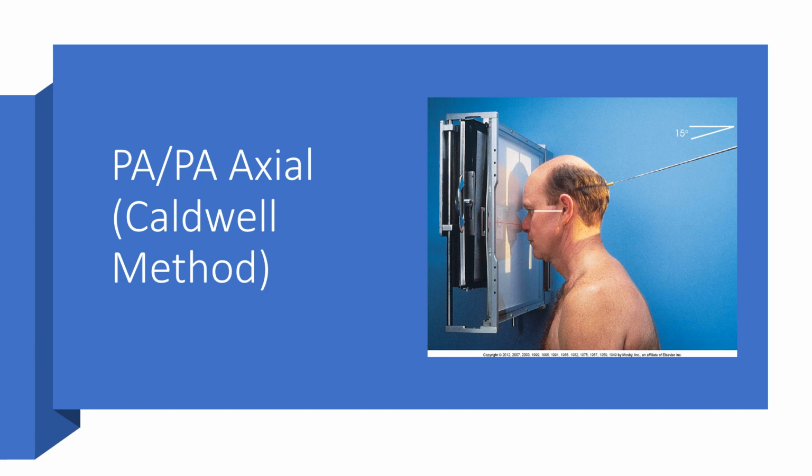Well, the easiest way to do that is, think about object A, B, and C. What we're going to do is take object B and line it up to object C, the image receptor, and then we're going to go back and take object A, the X-ray tube, and line it up to object C, the image receptor. So indirectly, the X-ray tube is lined up to object B, the patient's anatomy. You line both the patient's anatomy and the X-ray tube up to the image receptor, and that's the way I learned how to position a Caldwell.